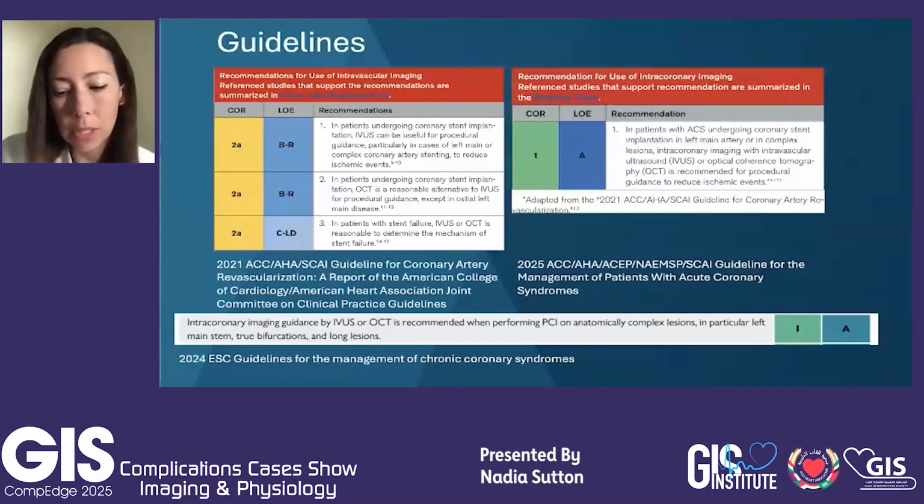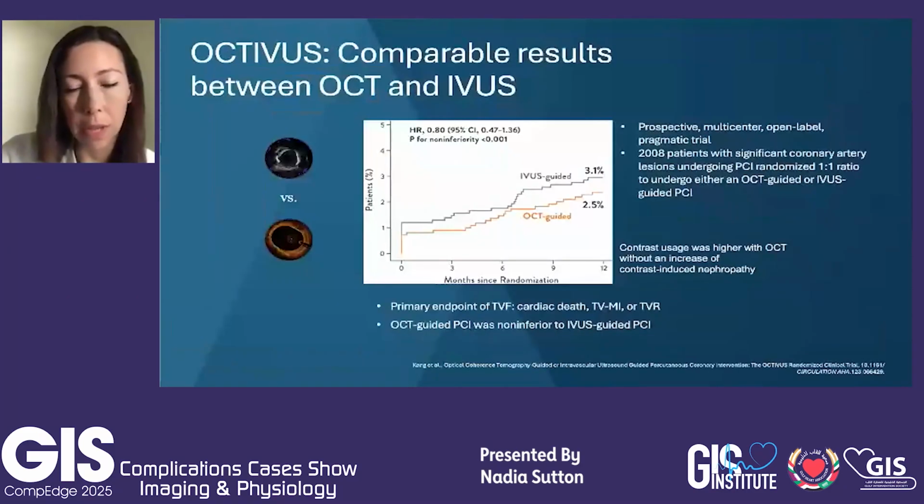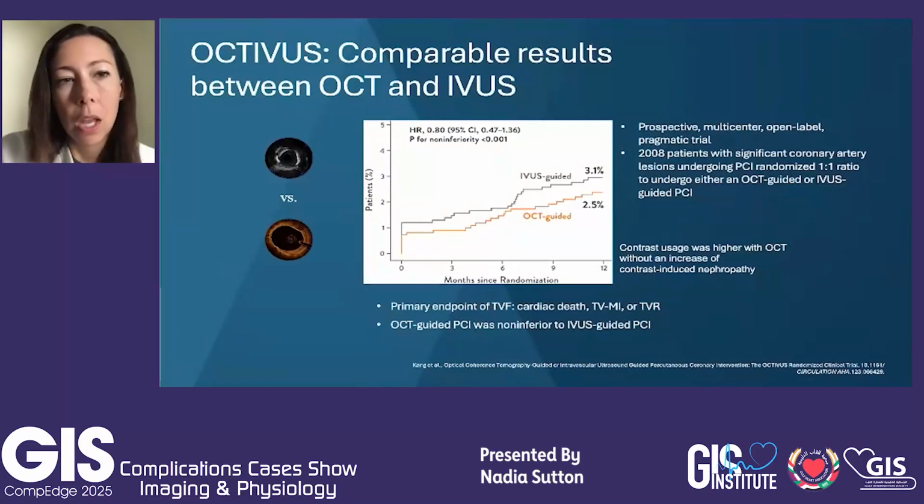So I do think this is a little bit tricky. I have sort of tended towards using intravascular imaging towards all of my coronary lesions, unless there might be some occasional exceptions. But I think that we probably have more complex coronary artery disease sometimes than we realize until we end up using intravascular imaging. So we'll be talking today a little bit about both IVUS and OCT.